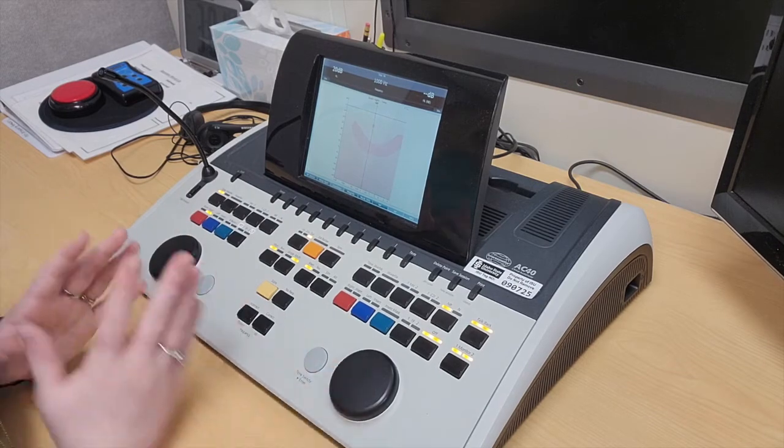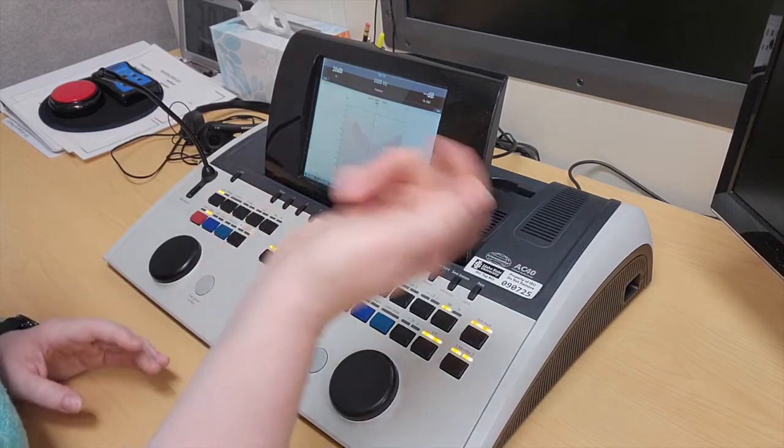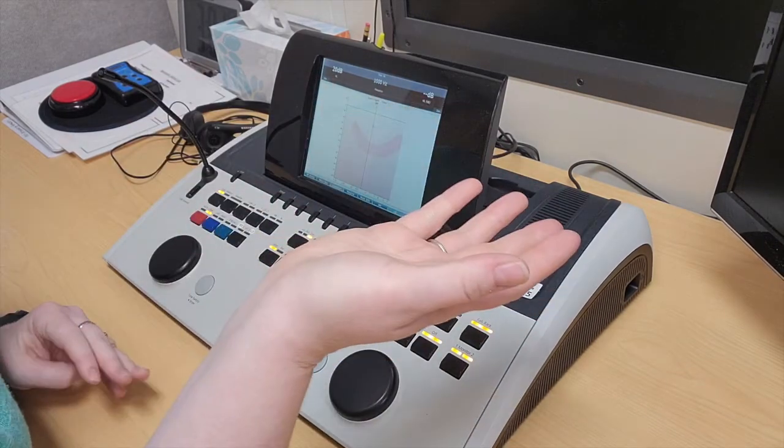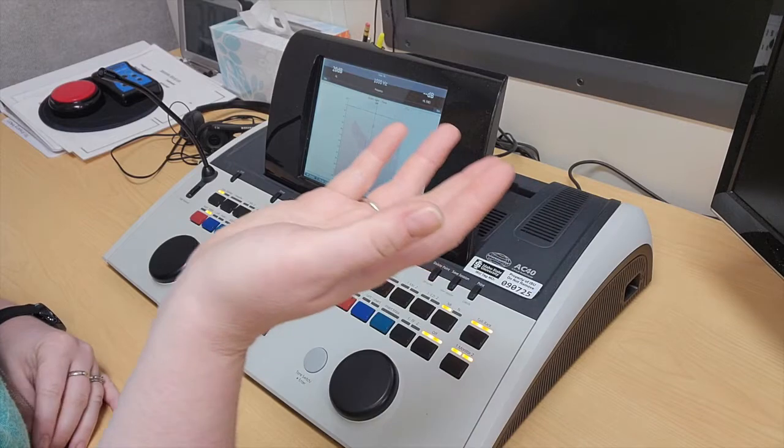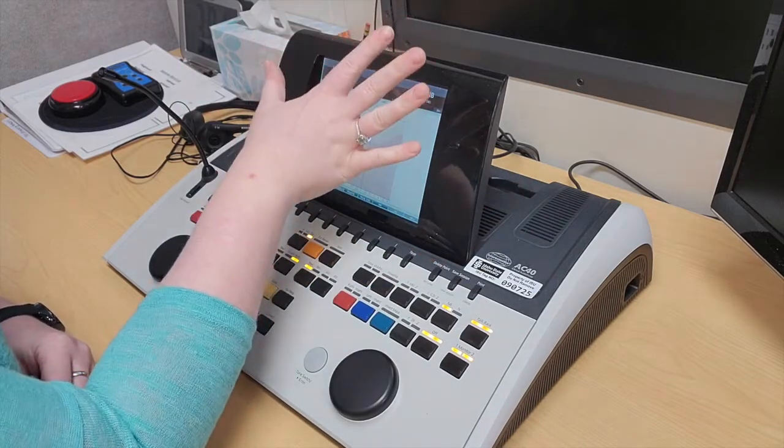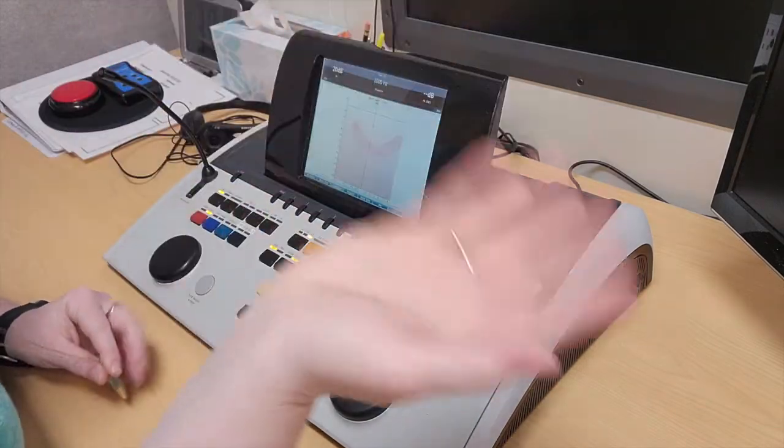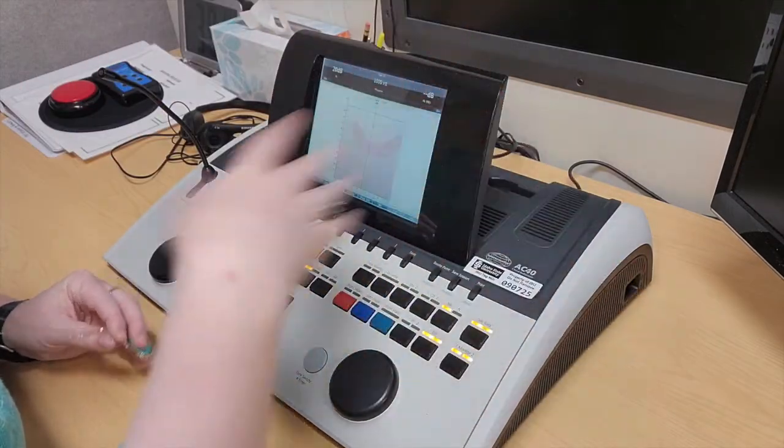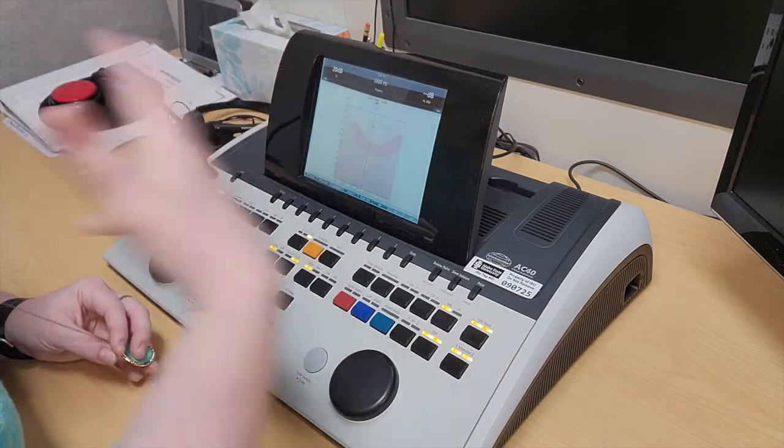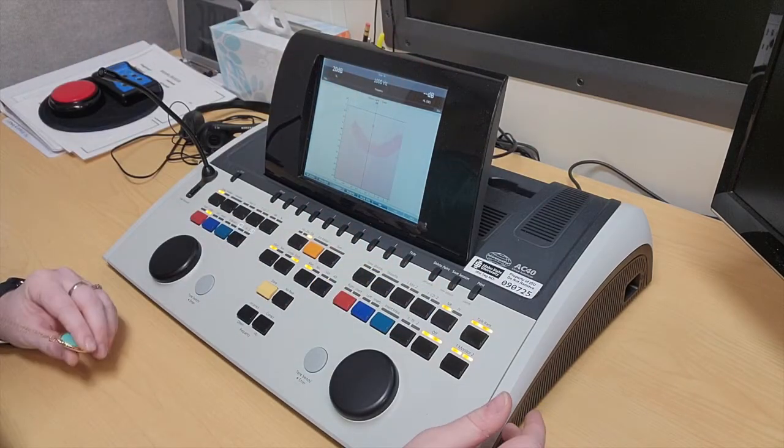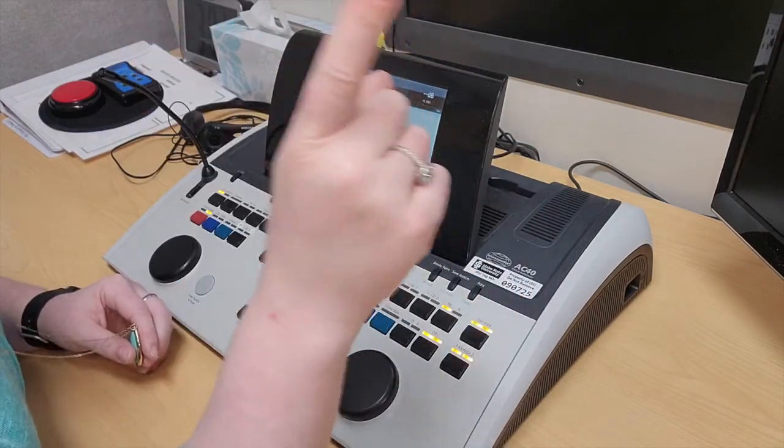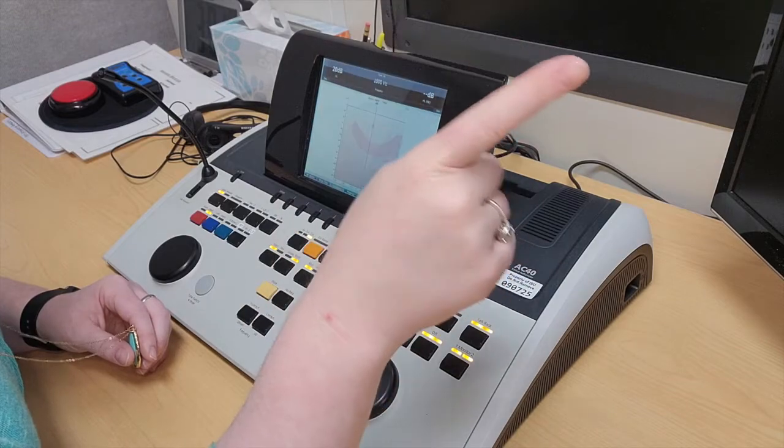Response methods include the button. If they're using the button, it would show up on here as blinking when they press it. You could have them raise their hand or verbally say yes. Some people just raise a finger like that.